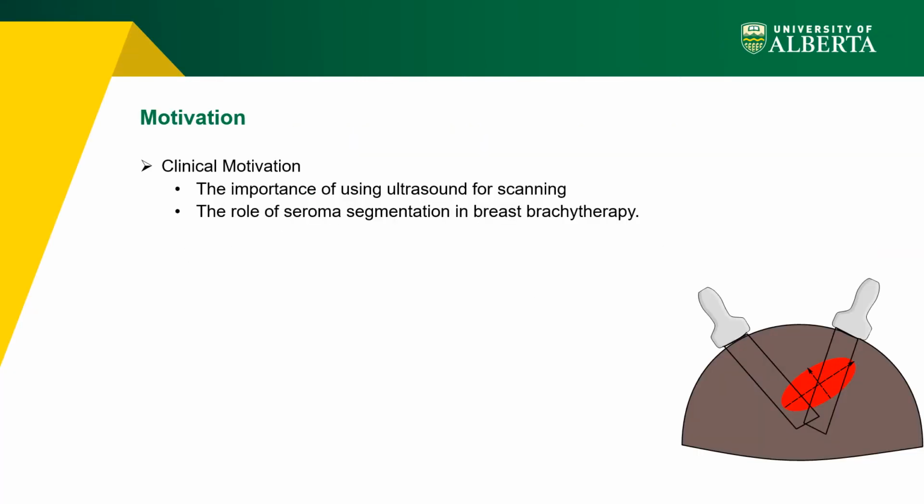Ultrasound is a widely used modality in medical imaging. It is a safe and low-cost medical image modality, but it has low signal-to-noise ratio compared to other modalities like CT or MRI. The orientation of the probe and sufficient contact between tissue and the probe are key factors for capturing high-quality ultrasound image. Breast cancer is the most commonly diagnosed cancer among women aged 30 to 39.